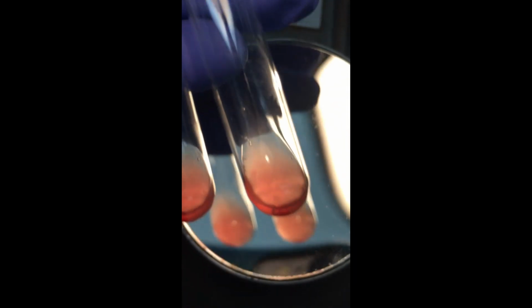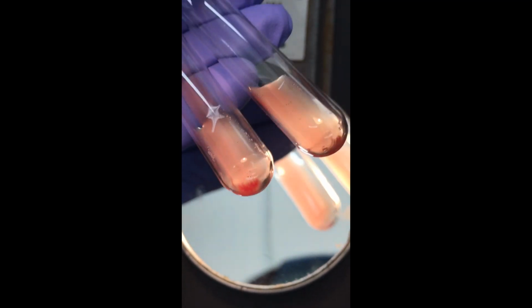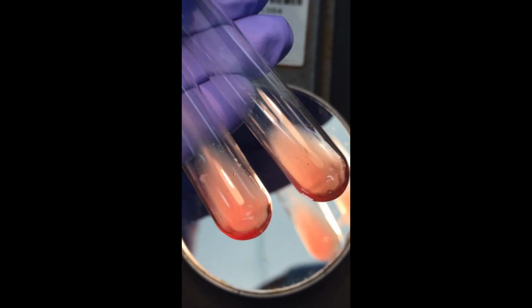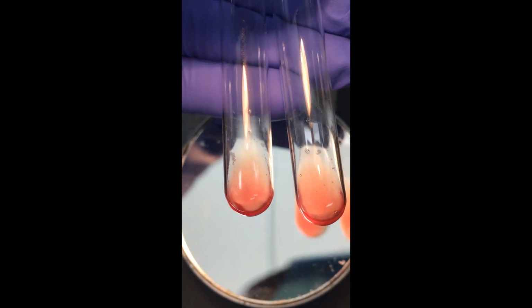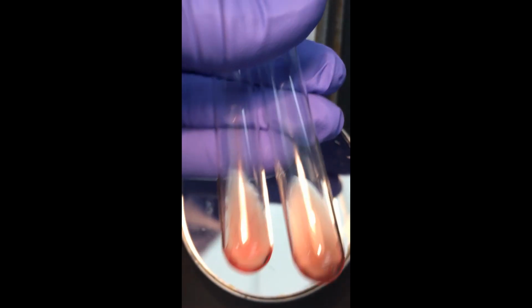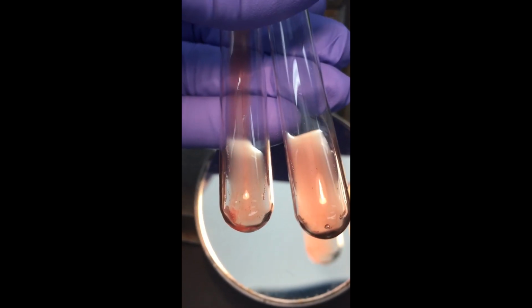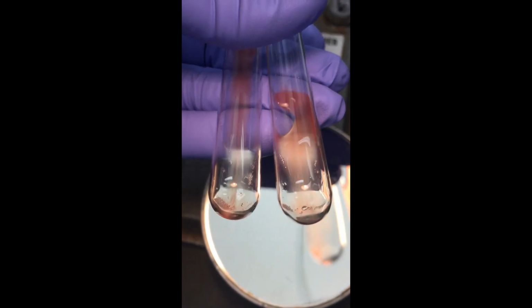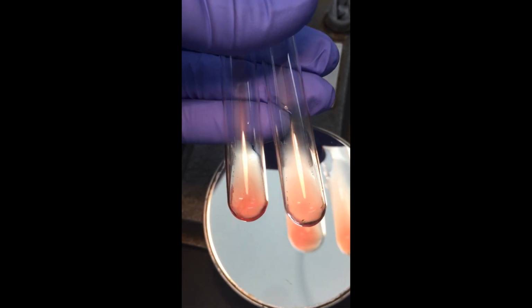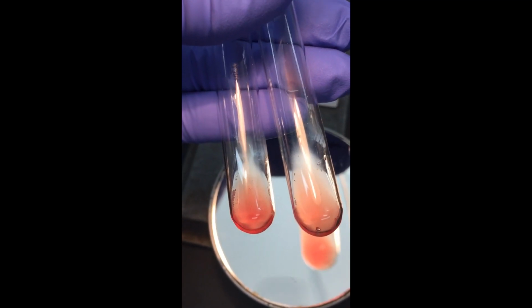Okay, so now the tubes have been in the incubator, the 37-degree water bath, for 15 minutes. You can see this is tube 1. Tube 1 is on the left and tube 2 is on the right. Okay, trying to get it. No, it has so much. Tubes 1 and 2.